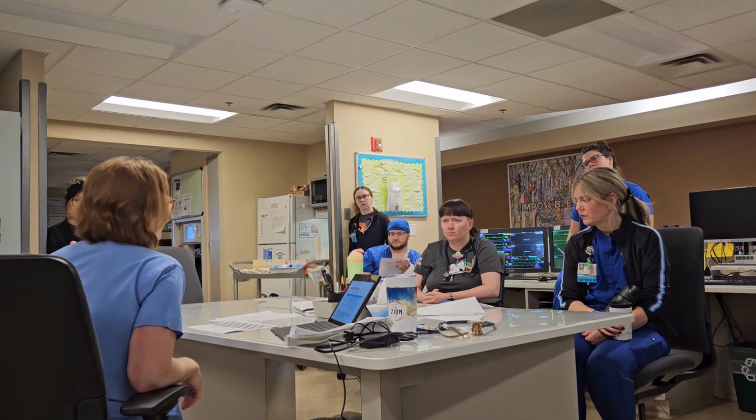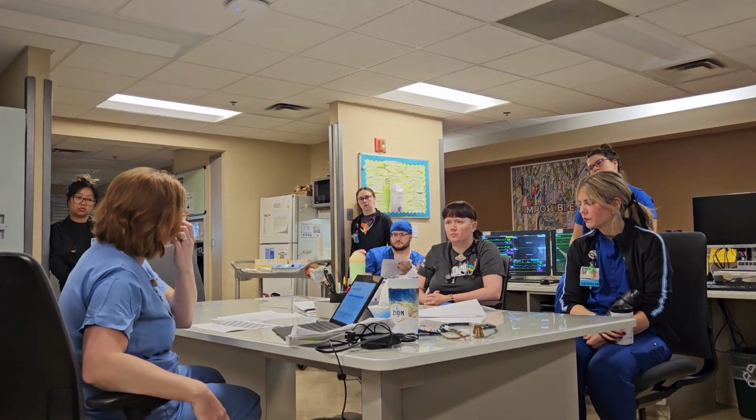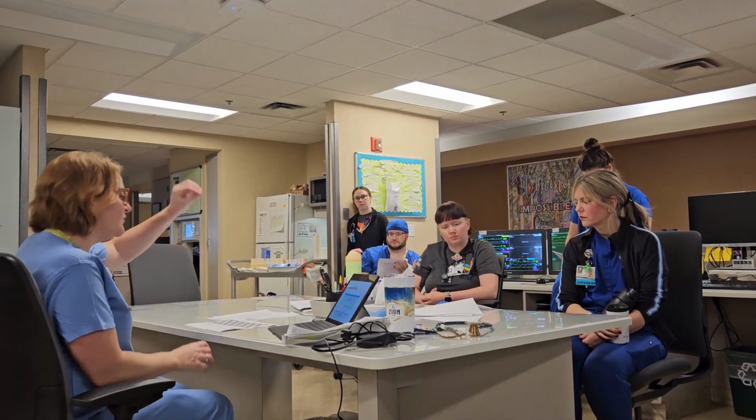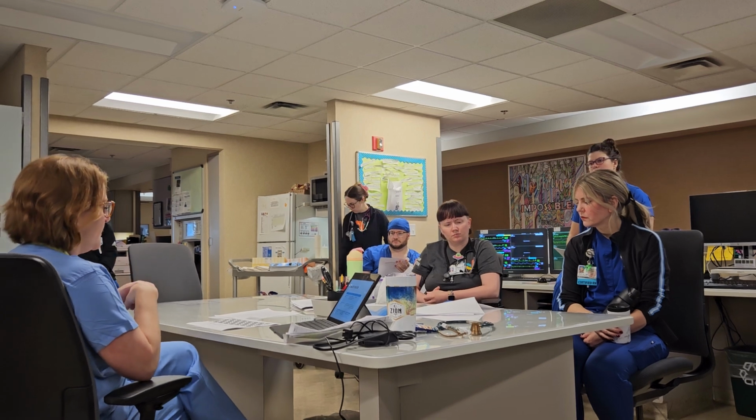With BiPAP, as you know, we can dial in backup rates. We can adjust the pressure to target a specific tidal volume, specifically for patients if we're trying to help them blow off that carbon dioxide.